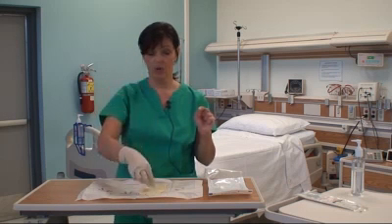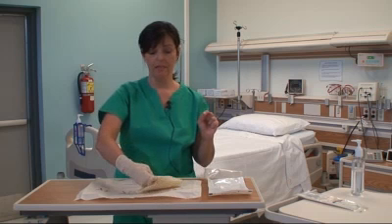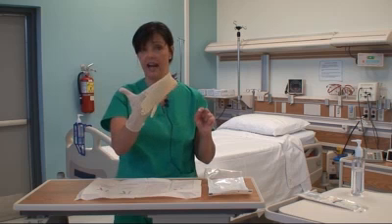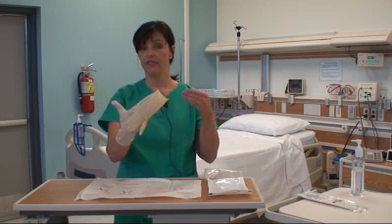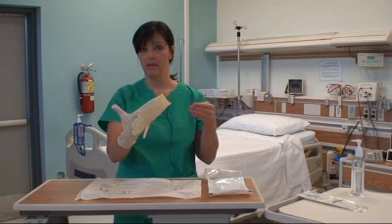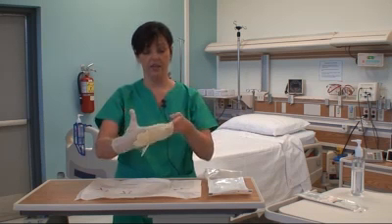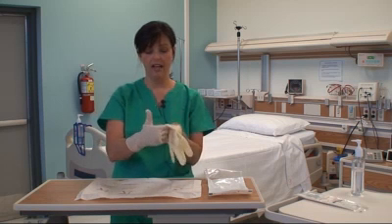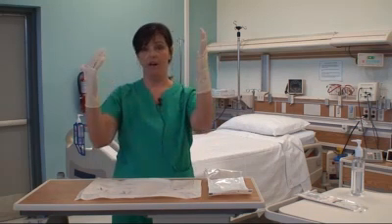Next, I'm going to don my left hand glove. I'm picking up my glove touching the outer aspect of the glove, which is sterile. I'm keeping my right thumb away from the glove so that I don't contaminate my right thumb. With my hand together, my fingers together including my thumb, I'm going to slide the other glove on.